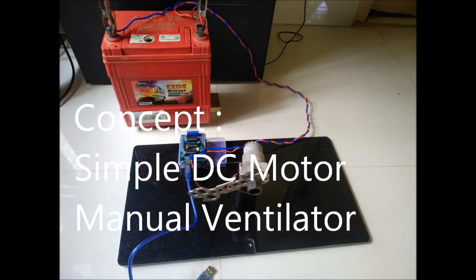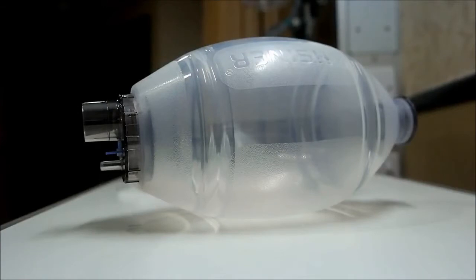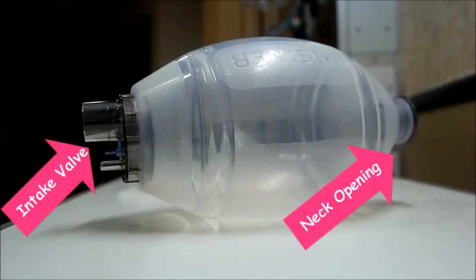Hi friends, today we are going to see the concept of design for a DC motor manual ventilator. There is an approved device called a manual resuscitator or BVM bag, generally called an Ambu bag. An effort has been made here to operate this Ambu bag with the help of a DC motor. We will see how this Ambu bag operates to understand, and then we'll go for the design concept.